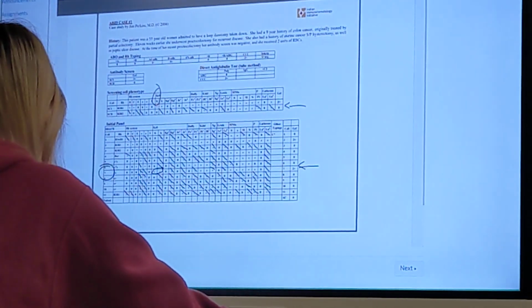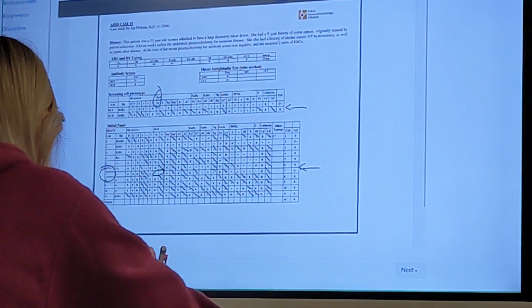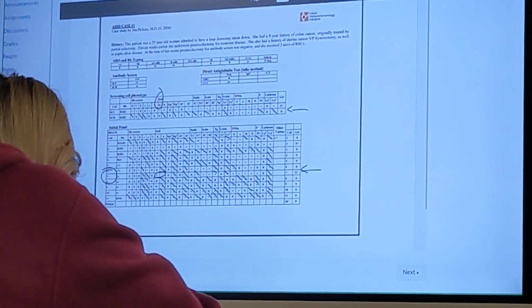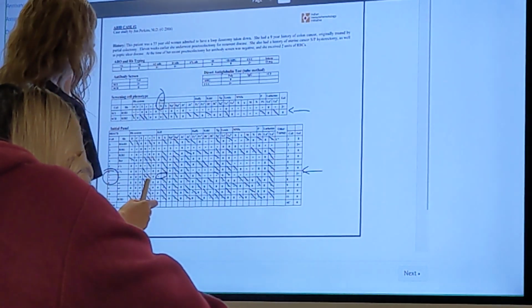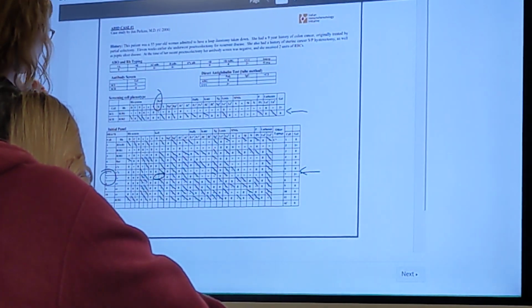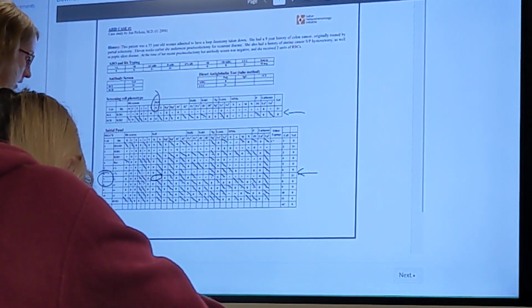Yeah. So if you got to the end and something didn't make sense, but you know an antibody's there, and you're thinking you ruled out everything, go back and look at it and see if you made a mistake. It happens, just like doing a Scantron. If you get off one line and then your whole thing's messed up, just do it again. Sometimes it's easier to just get another antigram and write your results down again and just start over if you made it too ugly.